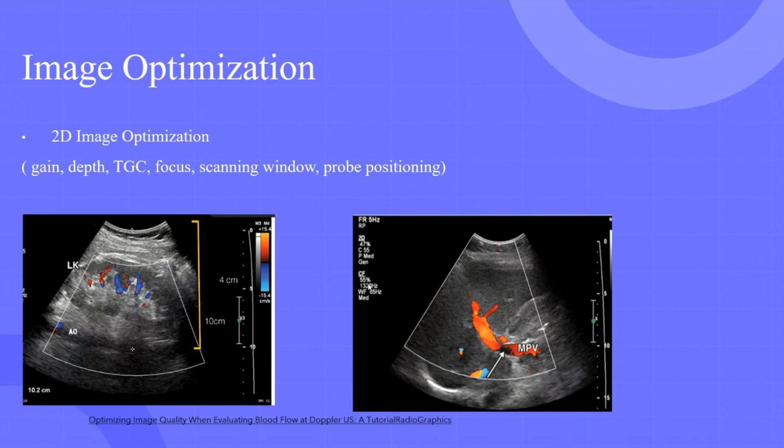The image on the right shows there's no vascular flow in part of the main portal vein because the ultrasound beam is perpendicular to the direction of the blood flow. To ensure the patency of the portal vein, we should try to change positioning, use the heel-toe technique, or try a different window. Try to see whether it's a technique problem or really there's some trouble there.